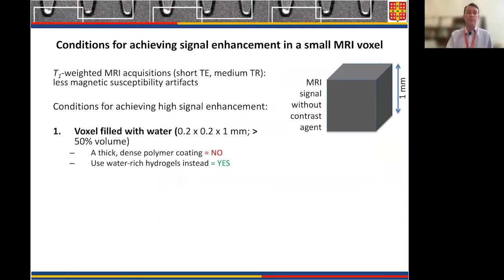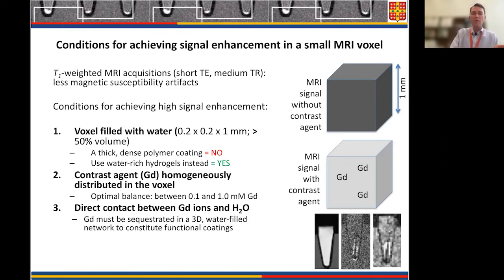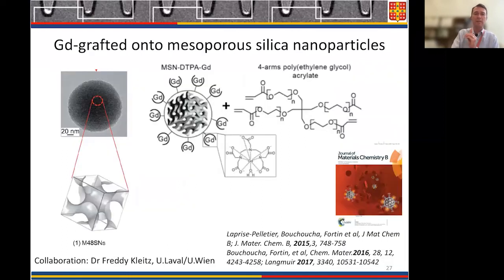And if you use gadolinium as a contrast agent enhancer, it can be gadolinium or manganese, you put that into the coating, and then it will accelerate the relaxation rate of water in the coating. And this strategy was used in our team to generate a contrast enhanced coating for metallic devices, and more particularly for biopsy needles in general.